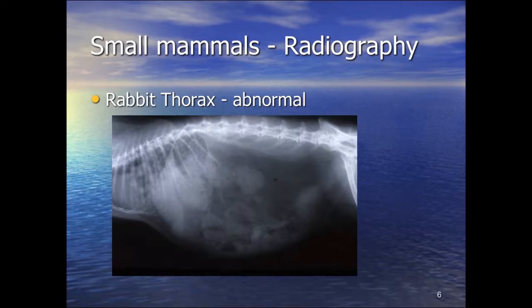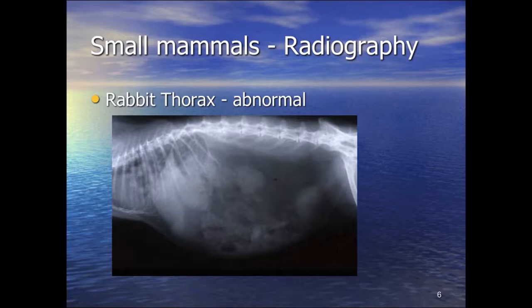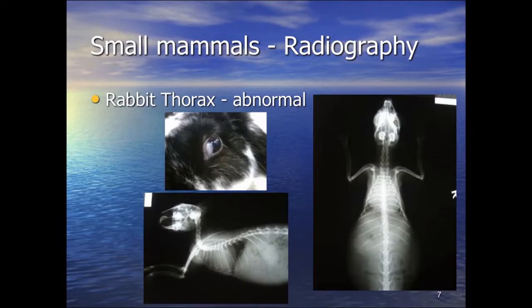This is a doe entire — these are cannonball metastases. This is almost certainly a uterine adenocarcinoma, though it could be a pyometra without these cannonball lumps in the lungs. Typically this is what we see with metastatic disease associated with uterine adenocarcinomas in bunnies. We're seeing perhaps a little bit of lipping in the vertebrae but nothing particularly serious in the way of osteoarthritis. This is a female rabbit that presented with dental disease as a referral — we can see a little bit of fluffy increased density and a radiolucency associated with a draining abscess and sinus tract associated with infection between premolar one and two in the lower jaw.